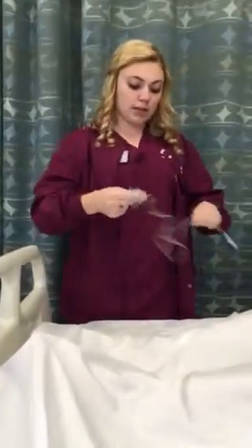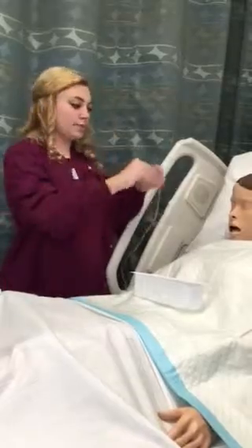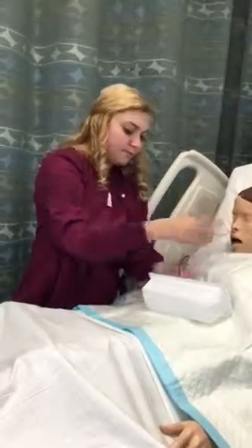Now when I take this out of the package, it's going to be kind of stiff, so I'm going to go ahead and coil that so it's good to go. And then I'm going to measure it to see how far I can go. So I'm going to go from the tip of the nose, around the back of the ear, and down to the xiphoid process. So that's going to be right at about 55.